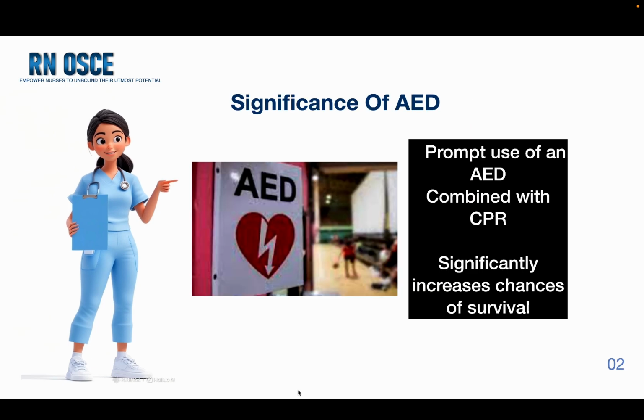Let's see the significance of AED. AEDs can deliver an electric shock to correct life-threatening arrhythmias such as ventricular fibrillation or pulseless ventricular tachycardia. It increases the chance of survival. It increases the survival rate if you can deliver the shock within the first few minutes of cardiac arrest. That will greatly improve the chance of survival.